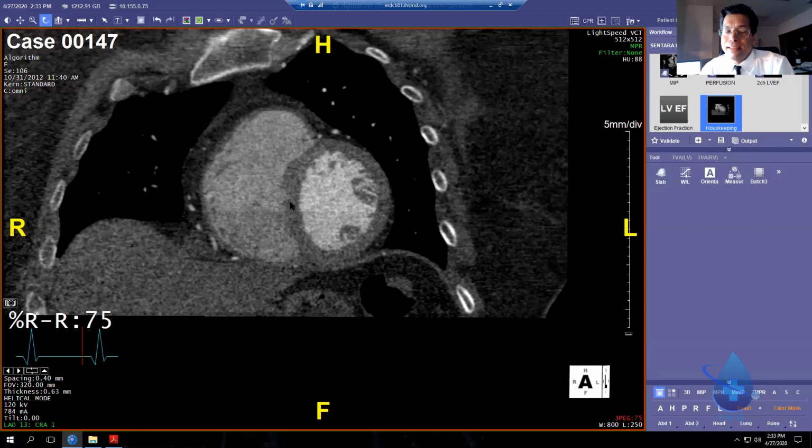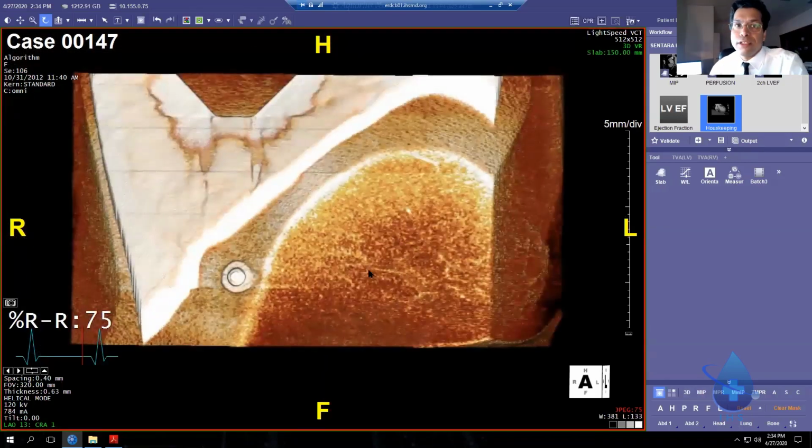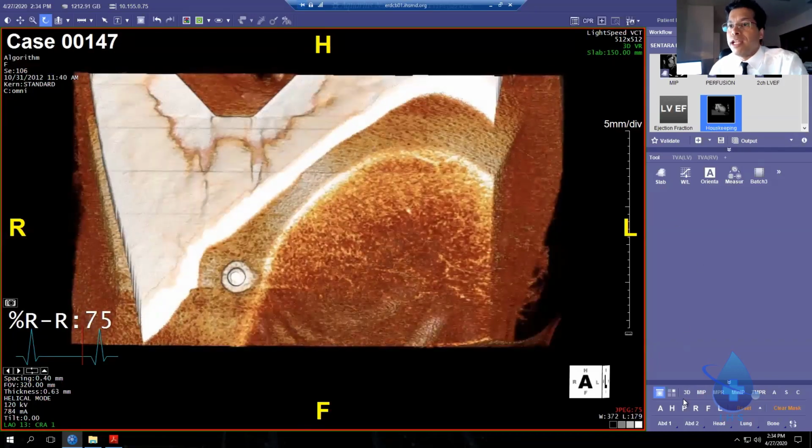It's not a big deal, so I don't want to focus on that today. Same thing with calcium scoring. Those are so easy, you're going to cry. So I want you to cry tomorrow, not today. Right now, you guys should be hankering to try. Before you do, let me give you a quick anatomy review of 3D anatomy, and then I'm going to let you guys read your first case, and I'm going to start pimping.